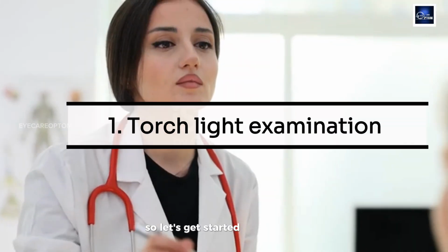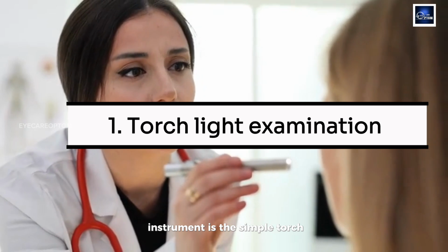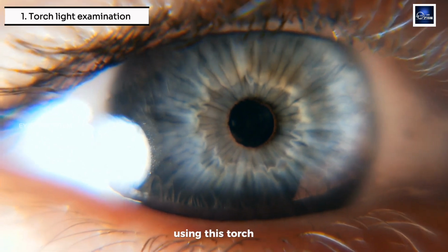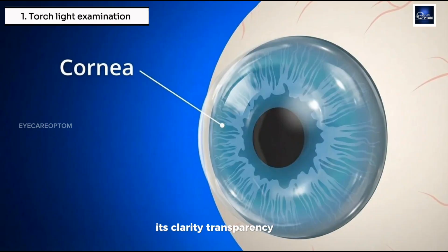So let's get started. The first and most basic instrument is the simple torchlight or pen torch. This is the starting point of any corneal examination. Using this torchlight, we check the external appearance of the cornea, its clarity, transparency, and surface regularity.